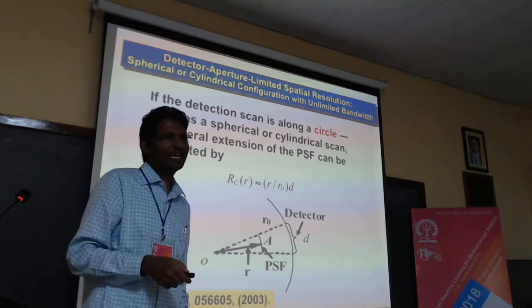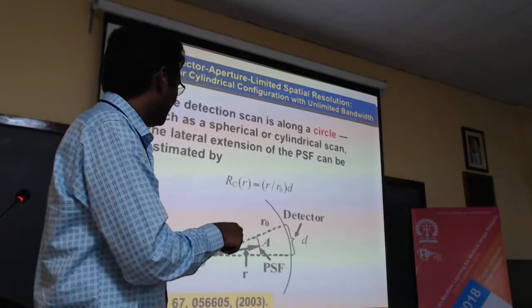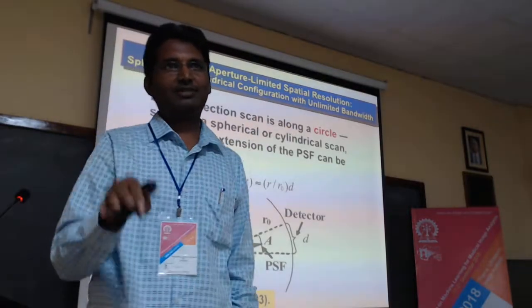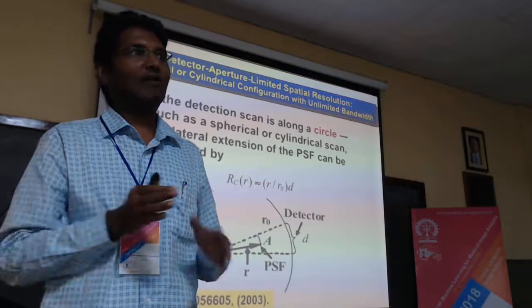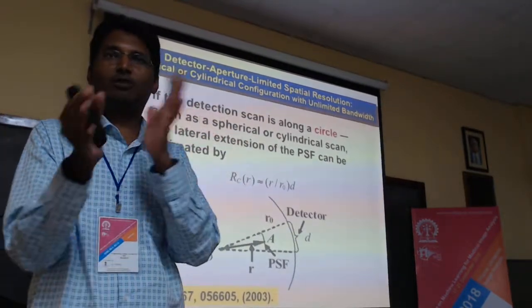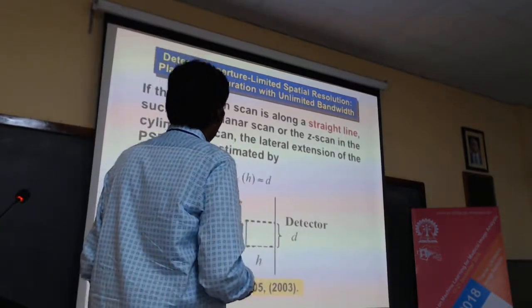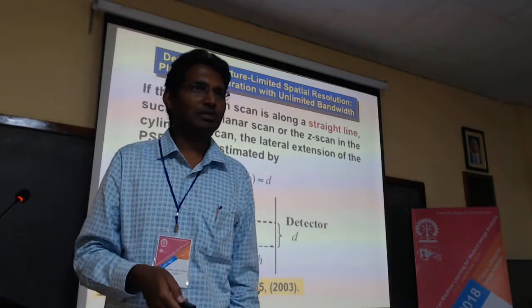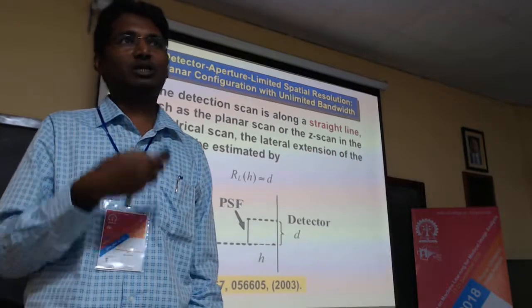Of course, it's going to be slightly more complicated than that, because the ultrasound detector is typically curved. You don't have flat detectors; curved detectors are what is common. When it is curved, you have an angle of acceptance, so you've got to account for that angle of acceptance. It's a little more complicated than what I was saying. If we are not doing an angle, but a sector-based approach, then it becomes a slightly easier problem to deal with. Then you talk about what is going to be the pulse width and things like that.